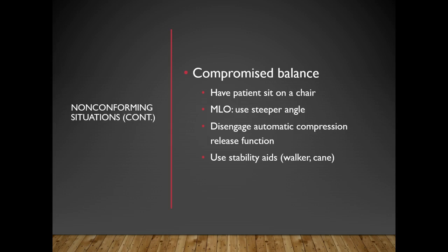And you want to be there with them when that happens. So that's why they're recommending to disengage the auto compression release. And then allow them to use their stability aids, have them near them, such as their walker or their cane.